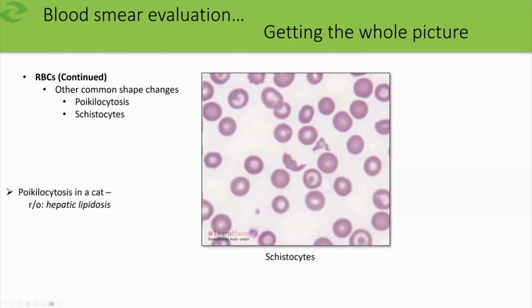Schistocytes. Schistocytes are fragmented red blood cells. This is definitely a fragmented cell. I think this one's also fragmented, kind of between an acanthocyte and a schistocyte there, but it's not real important that we definitively identify that one. These are target cells here, also known as codocytes. Sometimes they're called donut cells. They're not donuts. There, got some platelets right here.